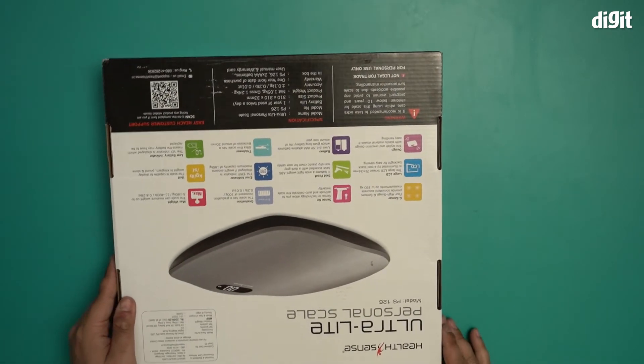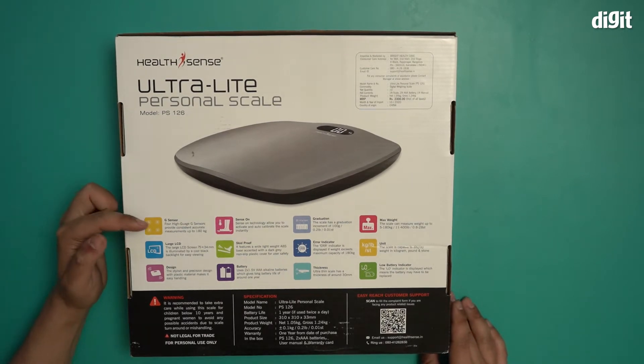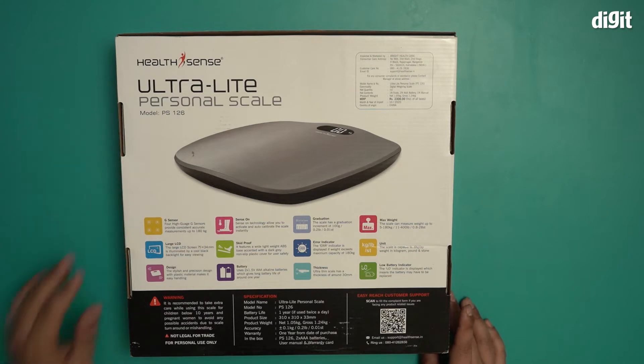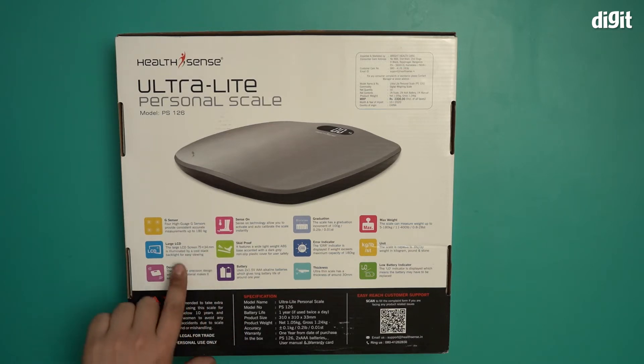At the back, let's see the specifications — let me just flip that over. It has four high-gauge G sensors that provide consistent, accurate measurements up to 180 kgs, so this will accurately give you weight of up to 180 kgs. It has a large LCD screen measuring 75 by 34 millimeters, illuminated by a cool backlight for easy viewing.